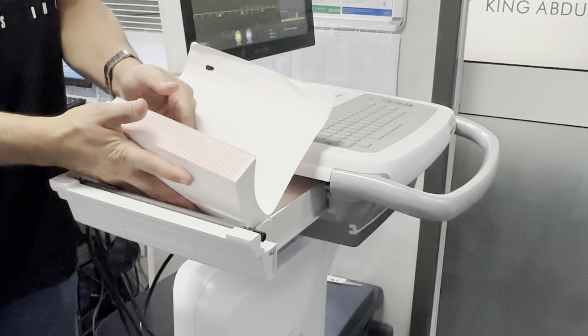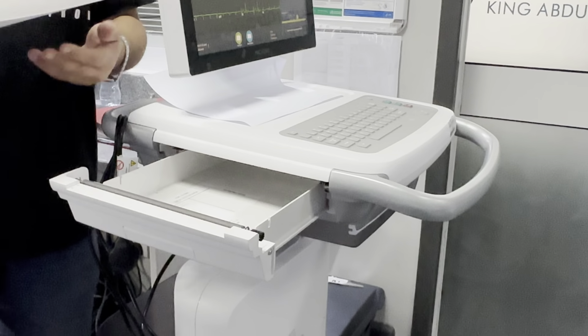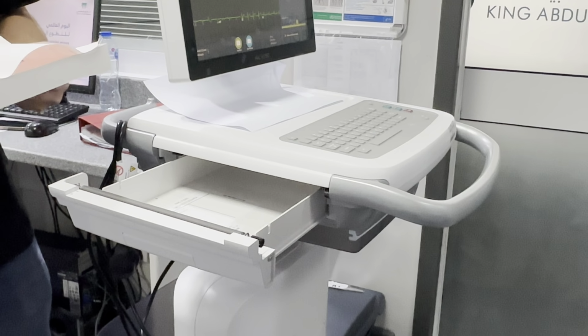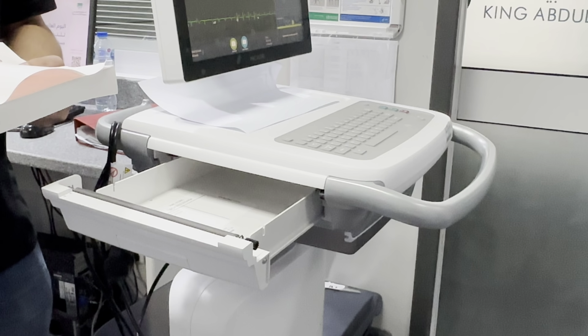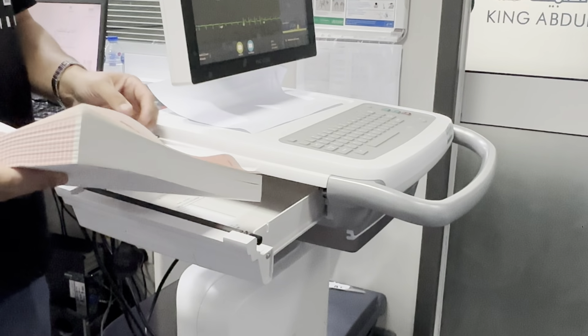Did you check the amount of paper before you run a rhythm report for your patient? You don't want to be interrupted in the middle. If your physician is looking for a 5 minute rhythm report, you cannot find yourself out of paper after 3 minutes and continue. You cannot continue. You have to repeat everything. So you must check the amount of paper.